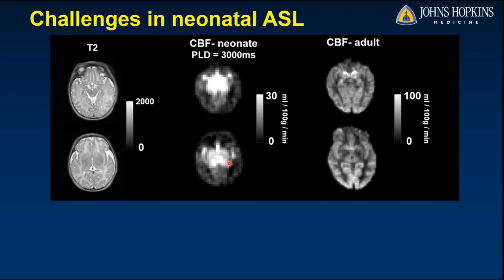The validity of interpreting these hyperintensities as real hyperperfusion remains questionable due to the rich presence of blood arteries within this region. Instead, macrovascular artifacts may account for these hyperintensities and therefore blur the measurement of real perfusion.